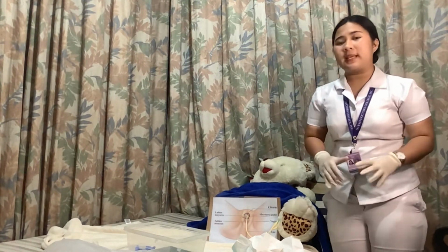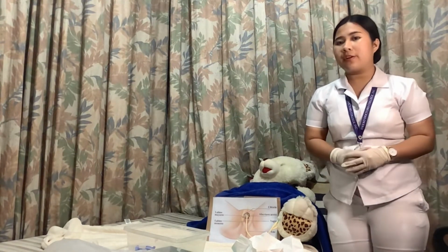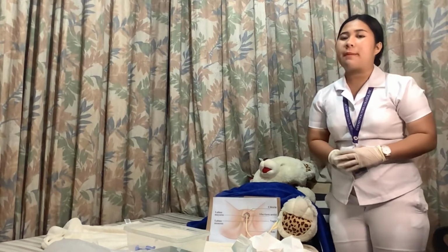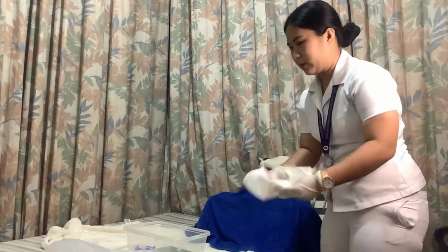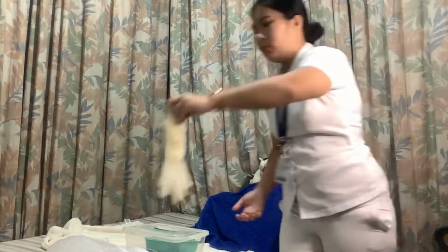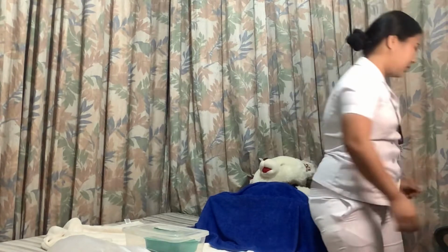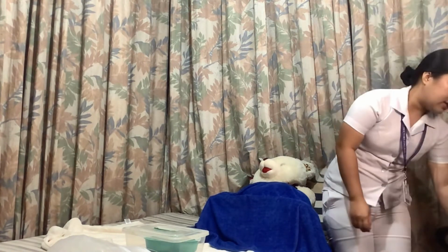Next, place the patient comfortably and do the aftercare and record the time of the procedure done, amount, and color of the initial output. Perform hand hygiene. And lastly, document.